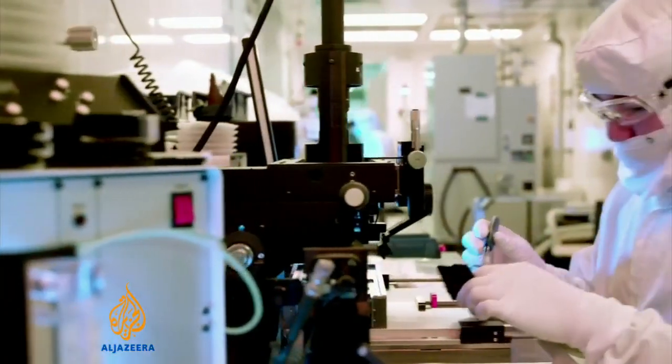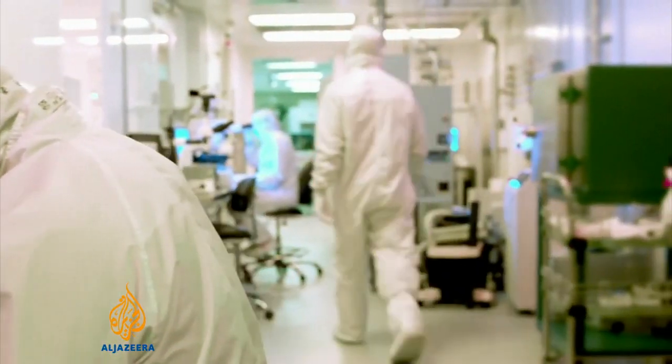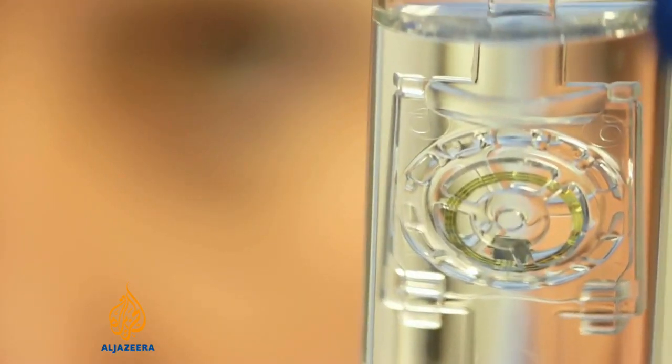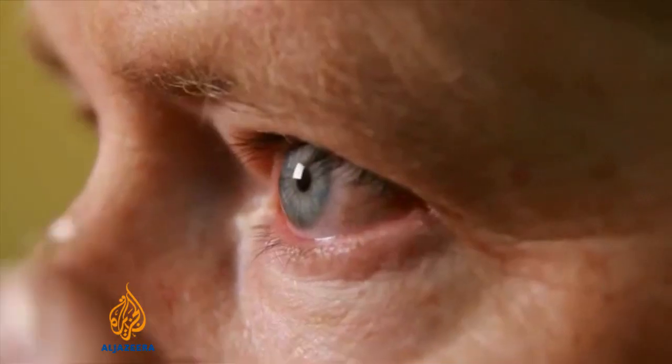Google says its diabetic smart lens is at an early stage of development and it's likely to be at least five years before it's available to the public. It does however reflect a growing interest in putting tiny microchips into medical devices — innovations the developers hope in time will improve our health.